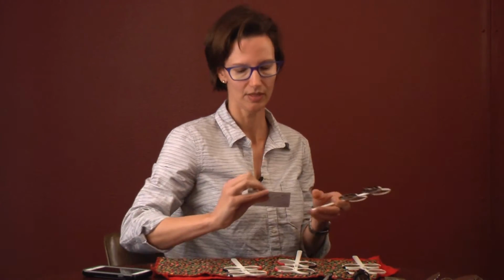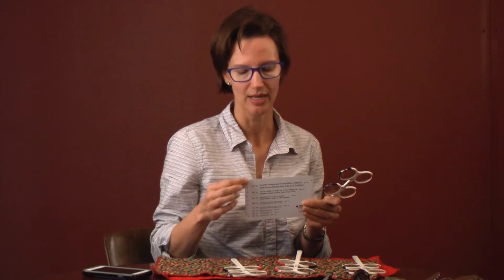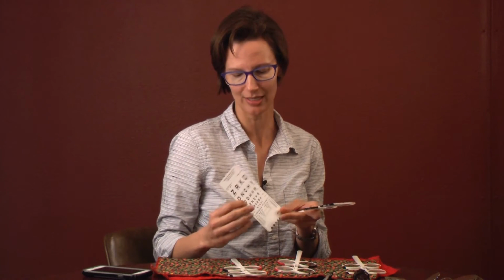And I give them a card that's pretty big. This is actually a Spanish card that I really don't even think the top line's big enough. A lot of these patients have cataracts or pterygiums, and I'll touch on that a little bit later, but a lot of them have poor vision to begin with, so they really may not be able to see this print, which is basically large print size. So I would usually try to show them something pretty big.